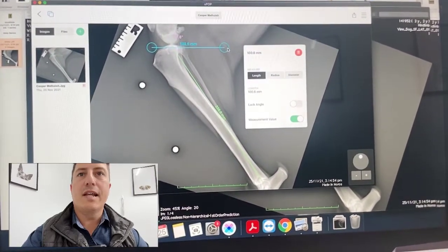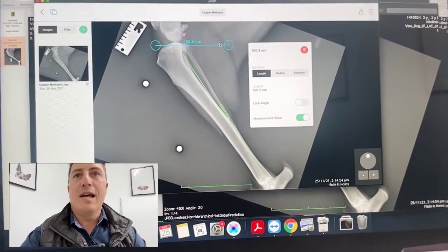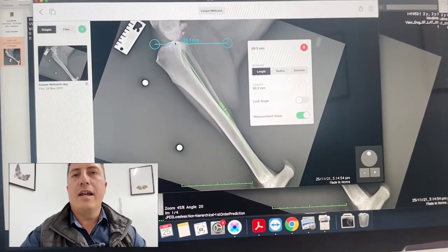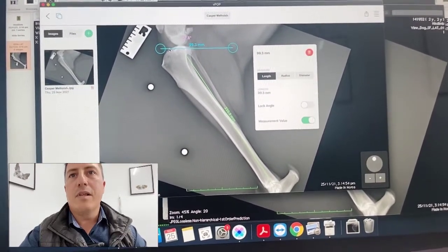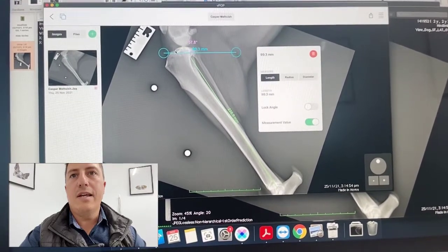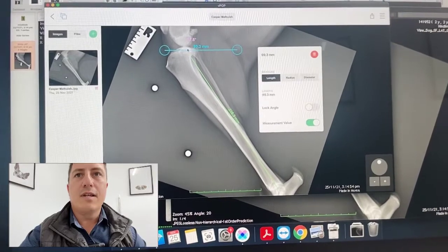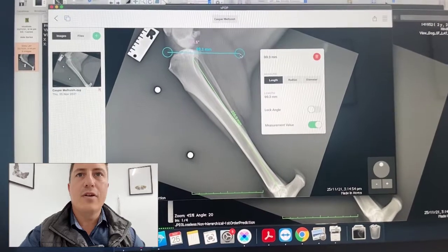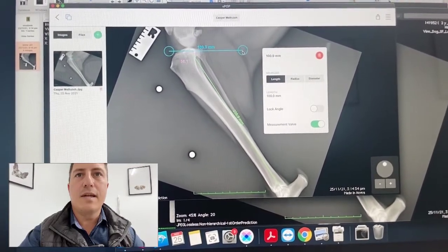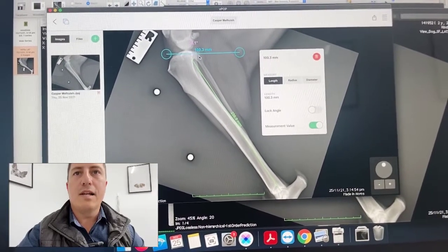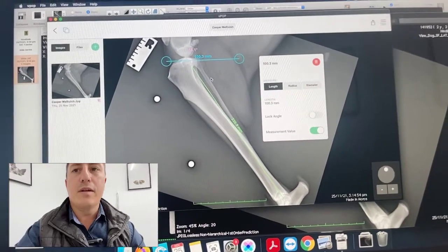As I click and get this top line oriented with the joint surface, we can see that changes accordingly. We'll round that up to about 58 degrees, and then I know that 90 minus 58 is going to be 32. So my tibial plateau angle for this case is going to be 32 degrees. The landmarks for this are the little indentation up here where the tibial plateau ends — that's the cranial landmark — and then I look at this line of sclerosis, the line of best fit, how it comes out to the caudal aspect of the tibial plateau. The popliteal sesamoid is just underneath it. So about 58 degrees gives us 32 degrees as our actual tibial plateau angle.